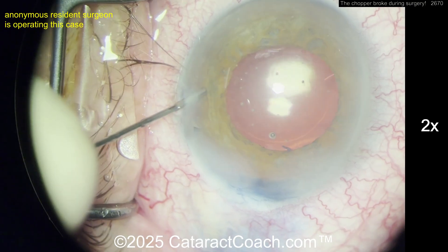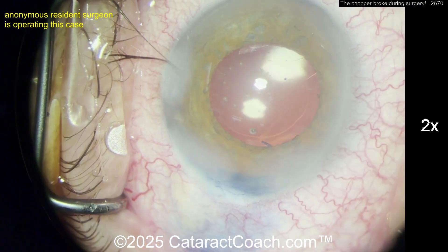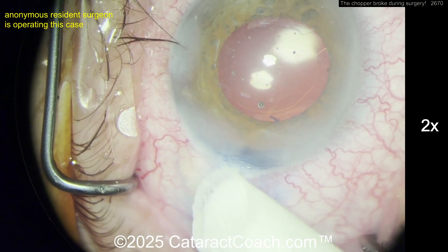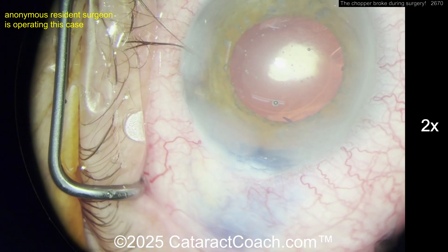This has happened before. I have an older video on cataract coach where we noted that — look on the cataract website for a video about a broken instrument inside the eye. It's not unheard of, and chances are it will happen in your career.